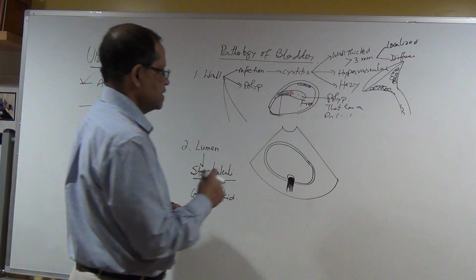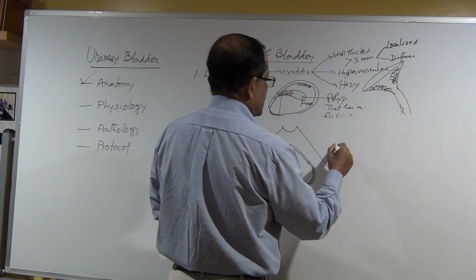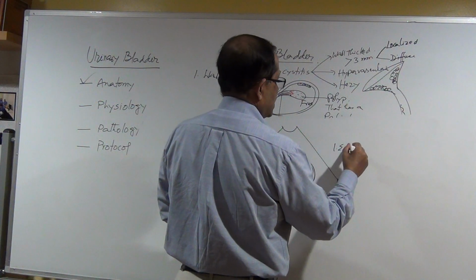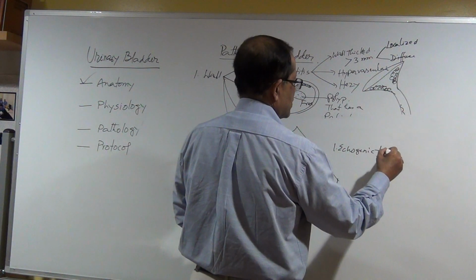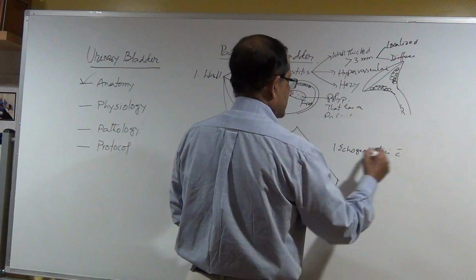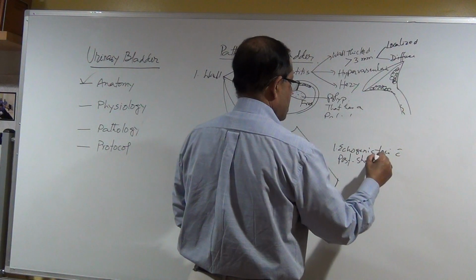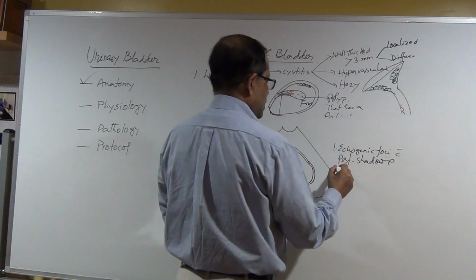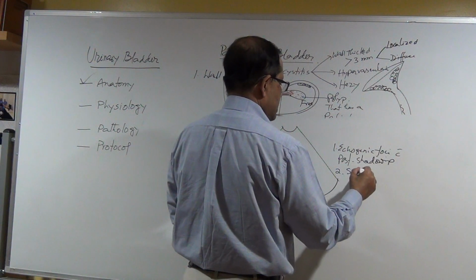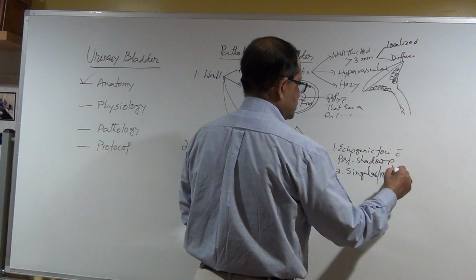What else? That means the characteristics of stone: echogenic foci with posterior shadow, singular or multiple.